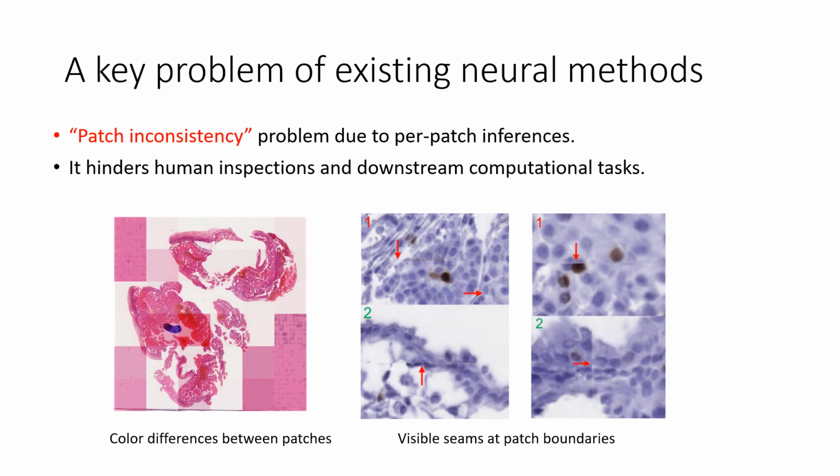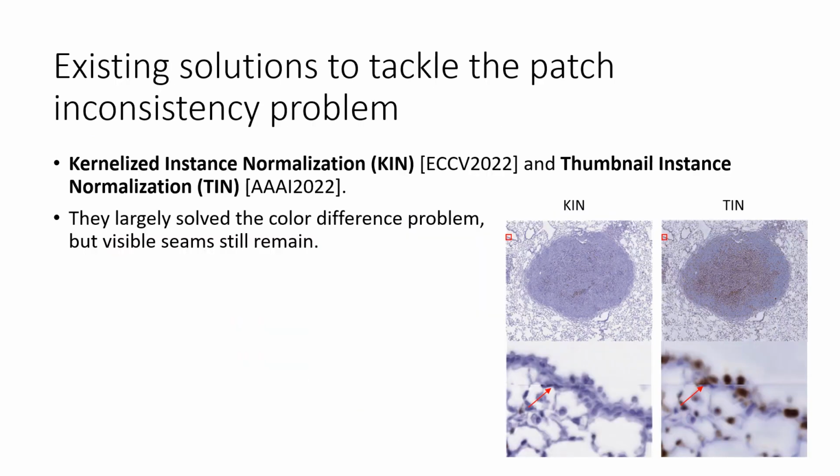However, for very large image inputs, which are common in practice, it becomes necessary to first partition the image into multiple smaller patches and run the neural network separately. This led to the key problem that the synthesized contents may look different between patches, causing color differences between patches and visible seams at patch boundaries. These artifacts are bad to look at and hinder performance of downstream computational tasks. Existing stain normalization methods proposed various solutions to minimize the color differences between patches, but the visible seam problems still remain. Some examples of such visible seams are shown on the right.